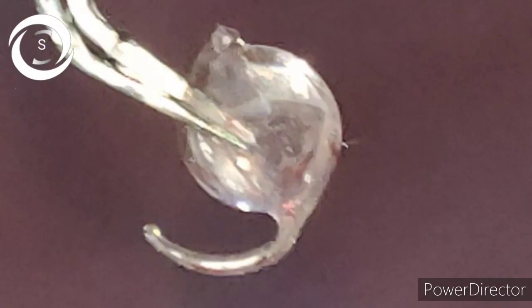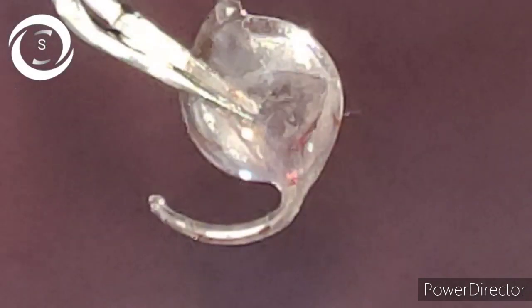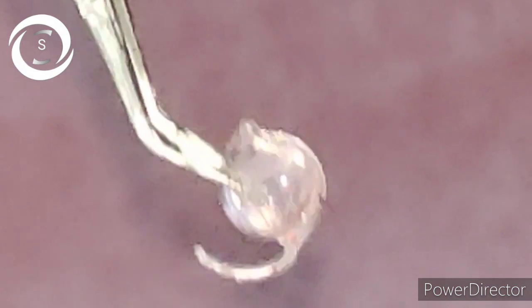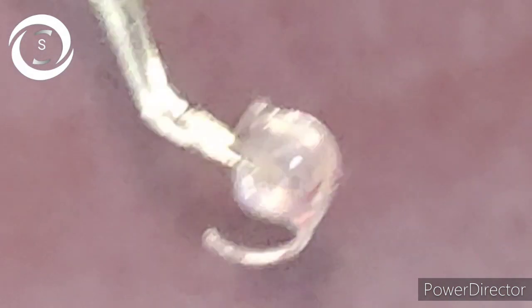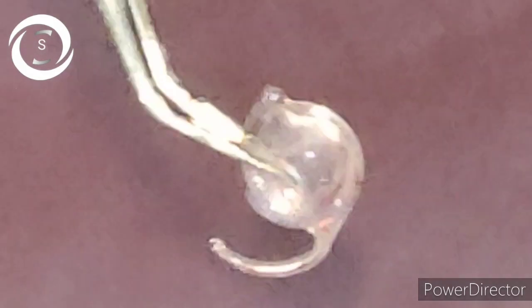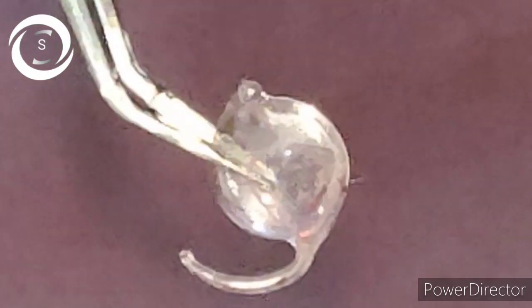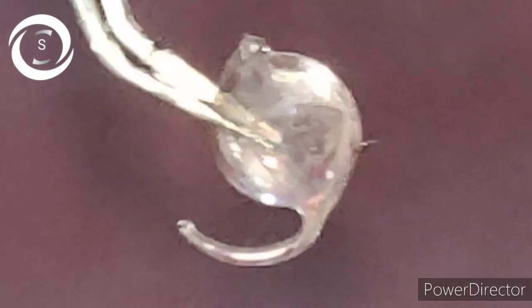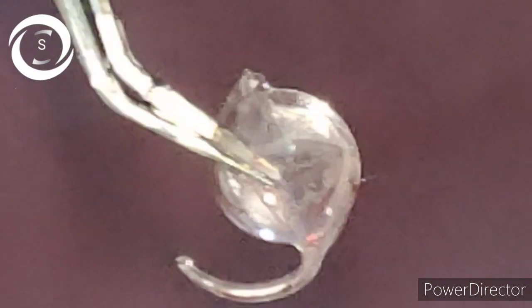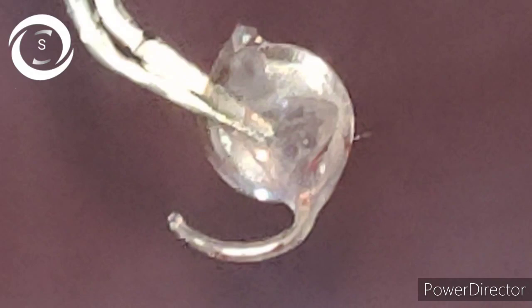From this video you can take three messages. Number one: always place the IOL carefully in the injector, otherwise it can be damaged. Number two: in case one haptic is entrapped in the injector while injecting the IOL into the eye, gently release the plunger — in more than ninety percent of cases, the entrapped haptic will be released unharmed.